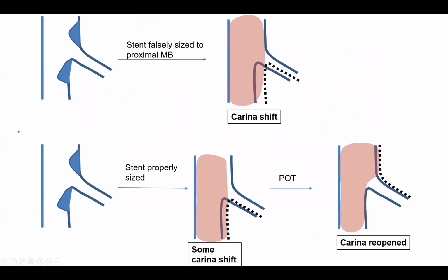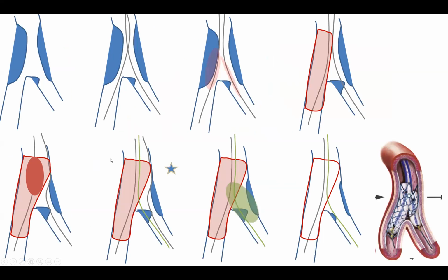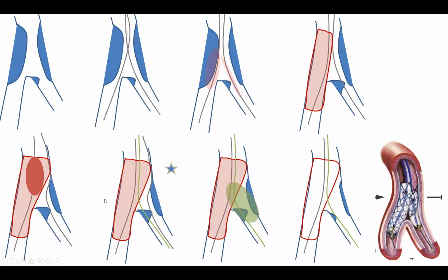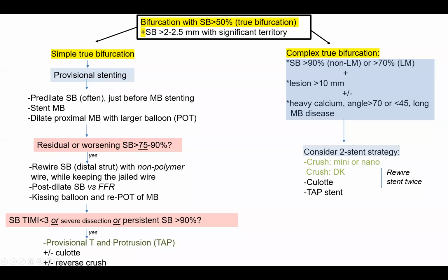So now I will go to the next step. So we did the POT, and now after doing that, we assess what's the result in the side branch. You have to decide after doing that, should I now touch the side branch? And the answer to that is yes.